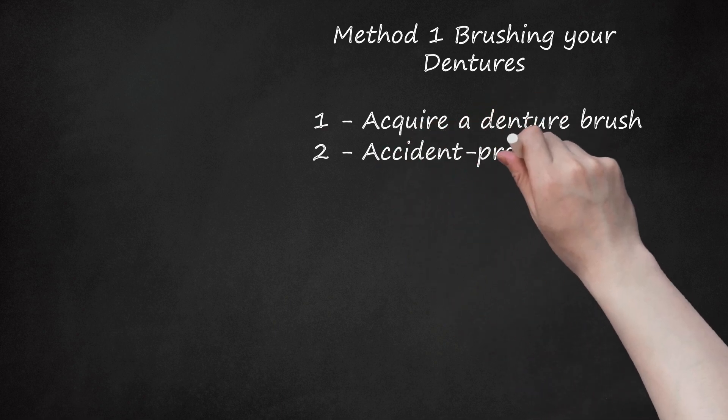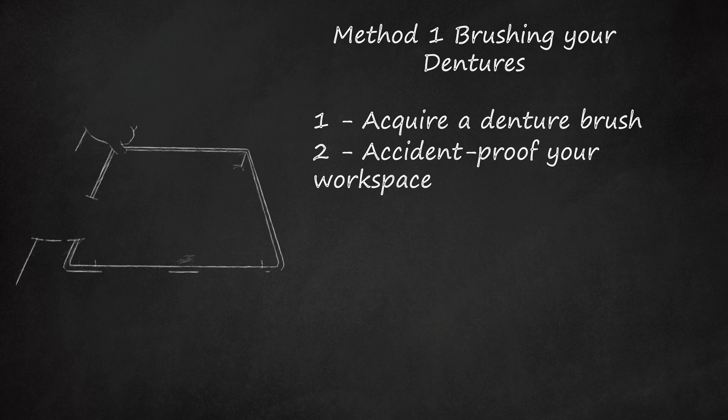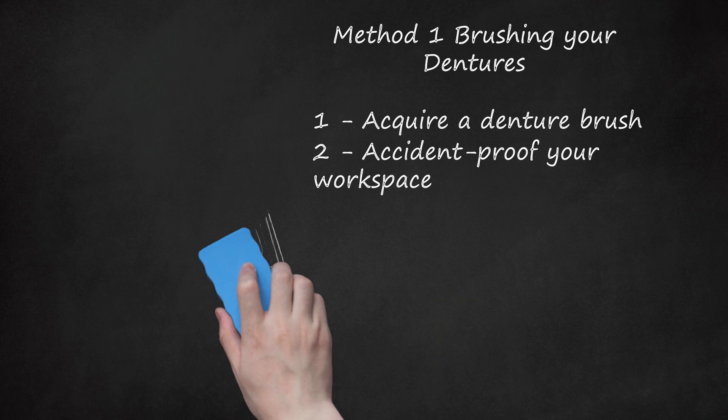Step 2: Accident-Proof Your Workspace. Start by accident-proofing the surface you will work over. Place a face cloth in the bottom of the sink and partially fill the sink with water to provide a cushion should the denture be dropped. Dentures can break if dropped on a hard surface. Grasp the dentures in your non-dominant hand, but don't squeeze too hard, as dentures can break.